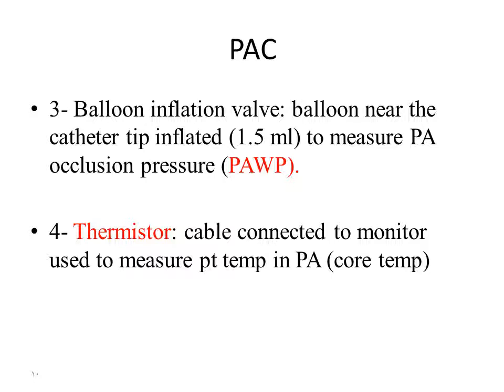The 4 lumen thermistor cable connected to the monitor is used to measure core body temperature in the pulmonary artery. هذول 4 lumens. إذا أضفنا additional lumen VIP اللي هو venous infusion port بكون صار عندنا 5 لومنز.